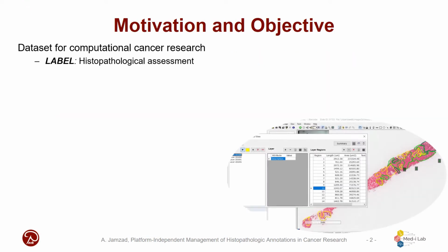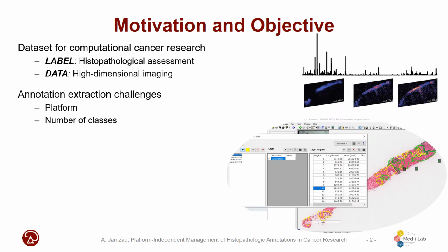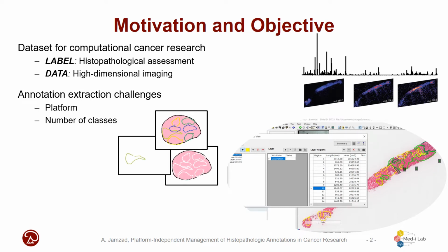Histopathologic examination of tissues serves as the gold standard in cancer research. Digital annotations are labels for high-dimensional imaging data. But extracting and mapping these labels remains challenging.